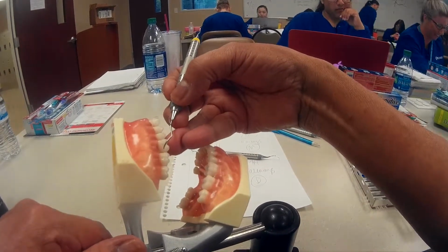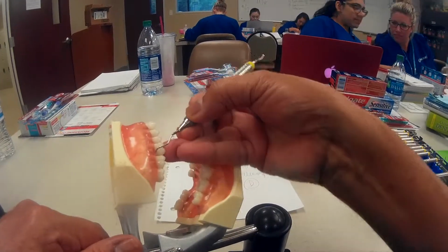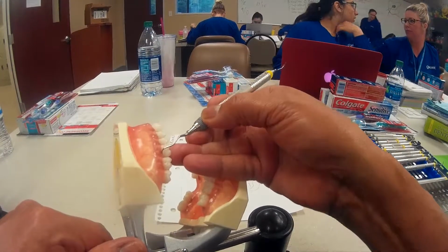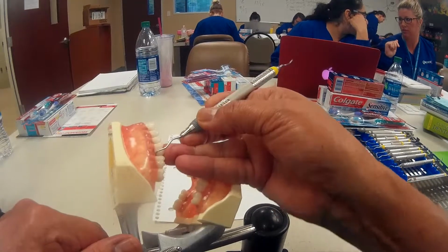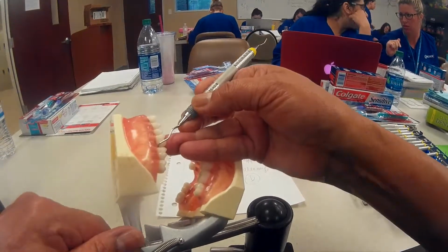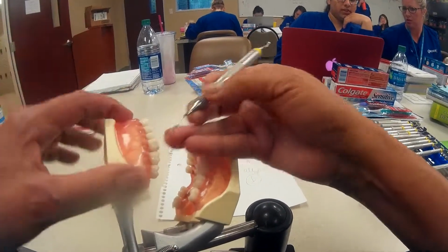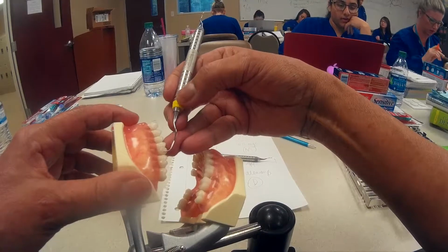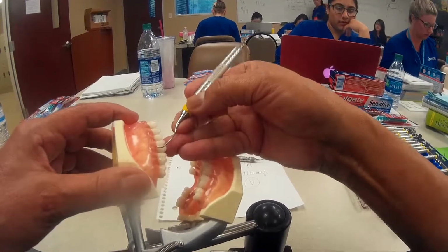And I'm going to go in like this, leading with the toe, stand up on my fulcrum, okay? And as you can see, the terminal shank is standing straight up and down. Okay, straight up and down. Flip it around, go back to your get ready zone. Now I've got horizontal strokes.